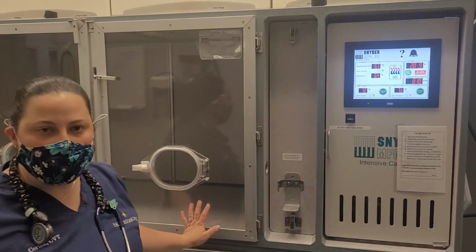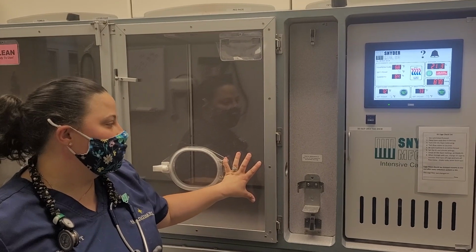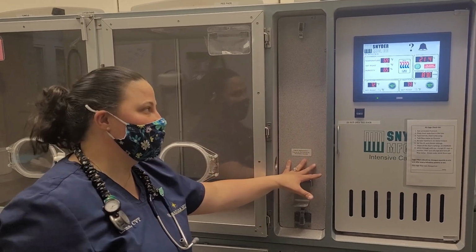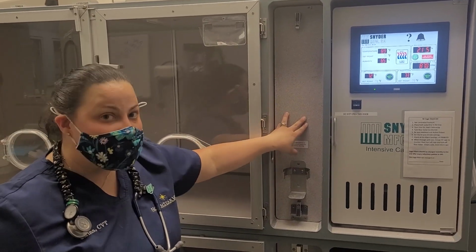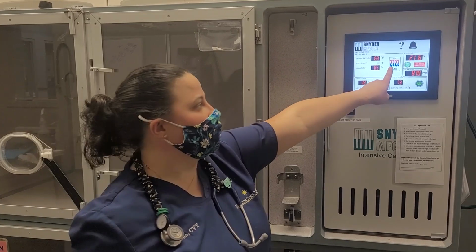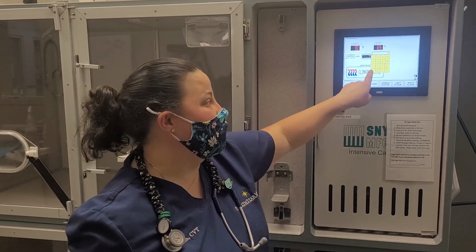If it's still a problem, you can take the animal and try to switch cages because then your condenser may be frozen and you may have to defrost it. To defrost it, you just have to basically keep this door cracked. You're going to want to turn off your oxygen and then set it to heat only. So you're going to hit your climate control. You're going to change your temperature to 90.